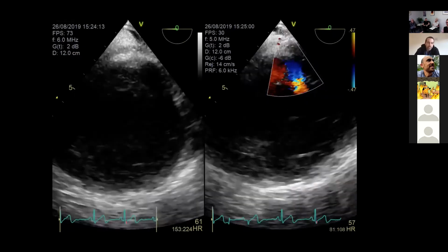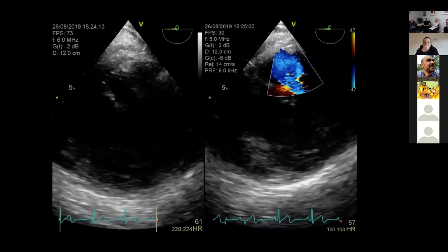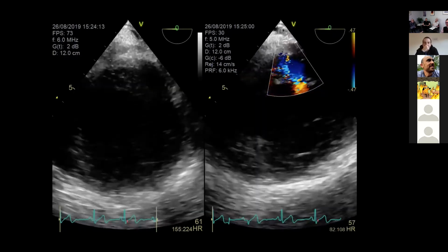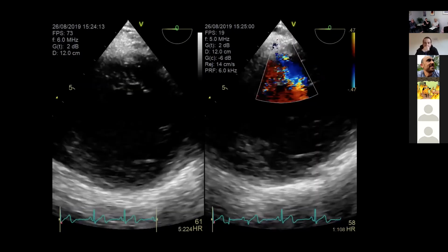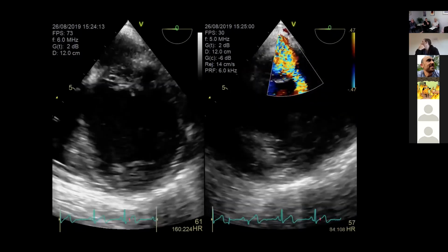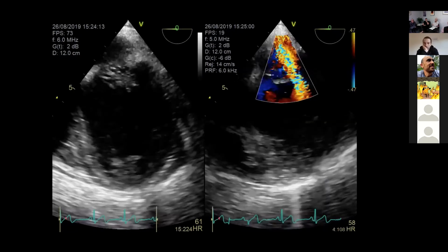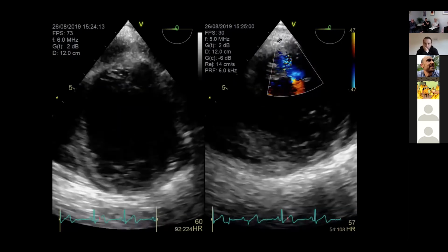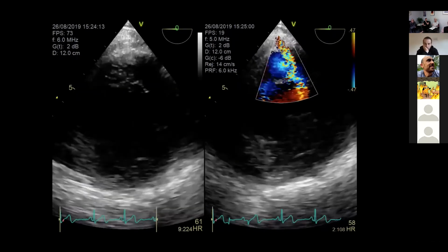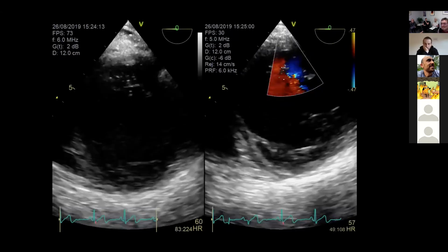Well, I guess there's a couple of things. What is the nature of this thickening? It is possible that this young woman has mitral stenosis and has just declared herself later in pregnancy. The mitral valve area, as determined on one of those previous images, was 3.2 centimeters, so not particularly stenotic. The question has to be made whether it's universally thickened or classically hockey sticked, and it's less classically hockey sticked.